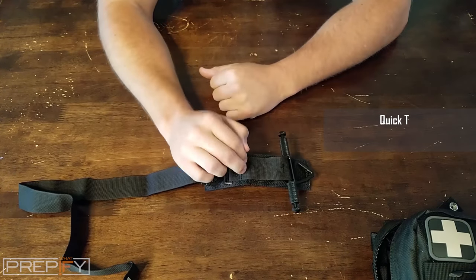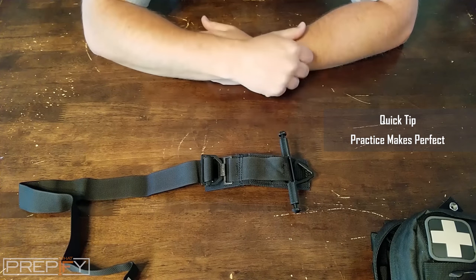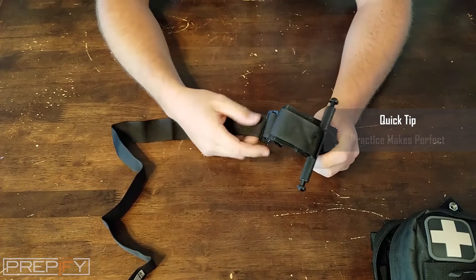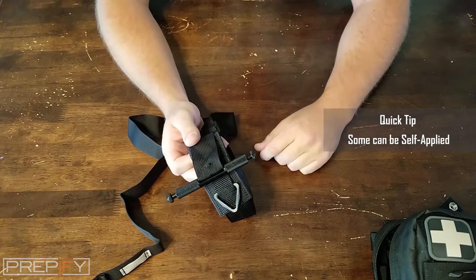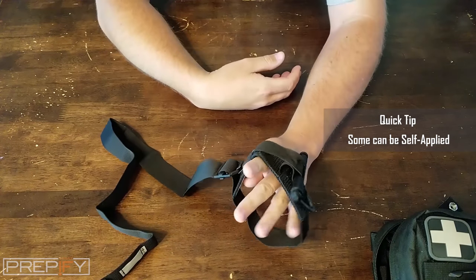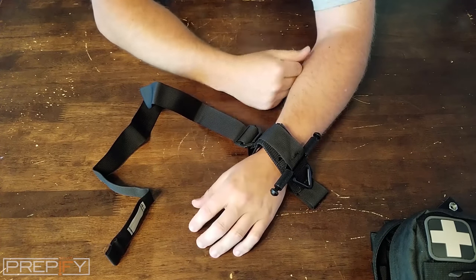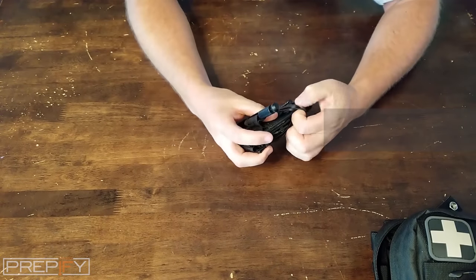Whichever tourniquet you go with, make sure you practice with it. Find a training one, or buy a couple, and save your real one for when you actually need it. One reason the military likes their personnel to carry this is that it can be applied with just one hand — you can grab it, fight it with your teeth to pull it tight, and then use one arm to twist it down.